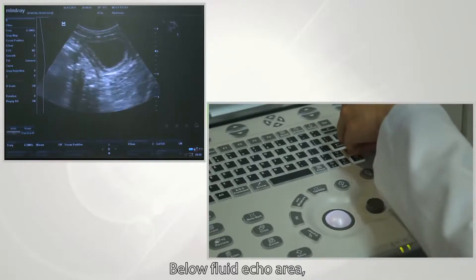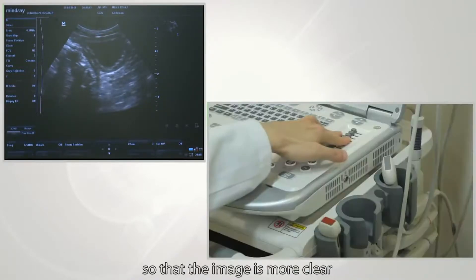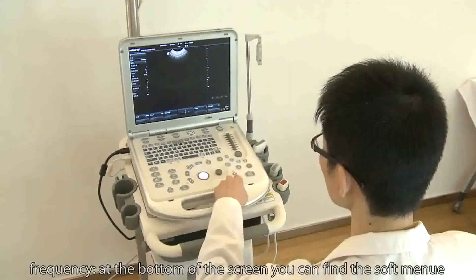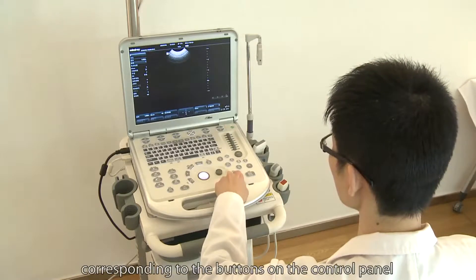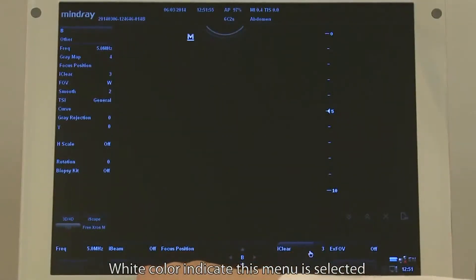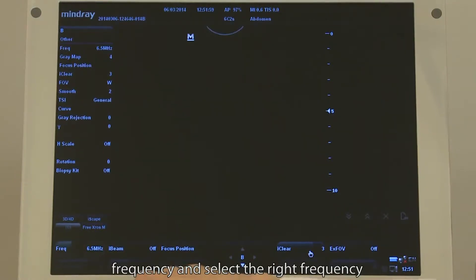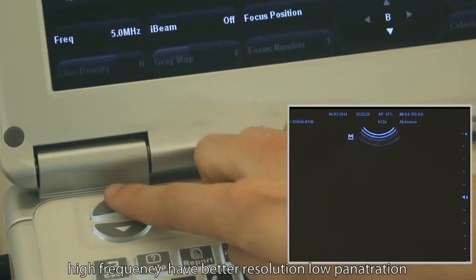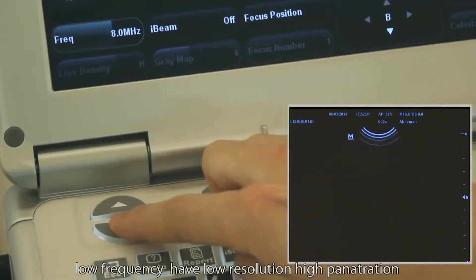The goal of TGC is to keep uniformity of brightness. Below a fluid echo area, adjust TGC to a relatively lower level so that the image is clearer. At the bottom of the screen you will find frequency. You can find the software menu corresponding to the buttons on the control panel. White color indicates the selected menu. Adjust the button corresponding to frequency and select the right frequency. High frequency gives better resolution but low penetration. Low frequency gives low resolution but high penetration.